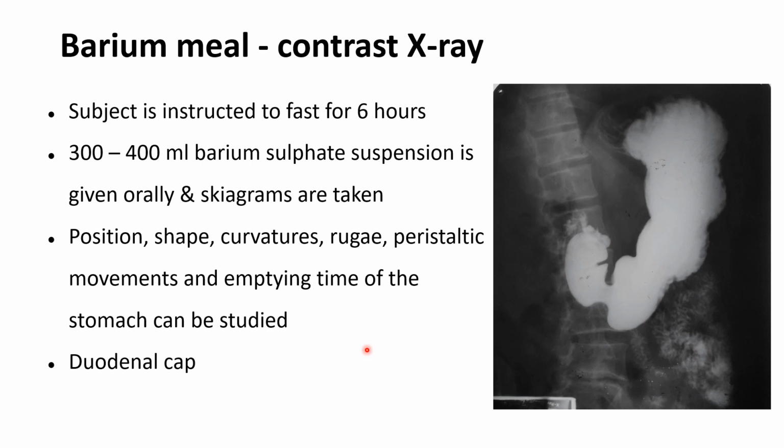And one more point to notice, in barium studies, the patient has to be prepared. So the preparations include the patient should have nothing to eat or drink for 6 hours prior to the barium meal study. And he should not smoke, take medicines or chew gums during this period. Another point to note is no purgatives should be given the night before the examination, as they will tend to cause misleading motor phenomena.